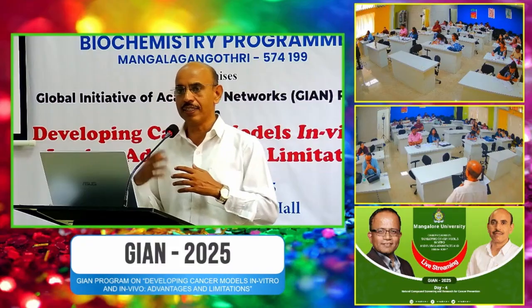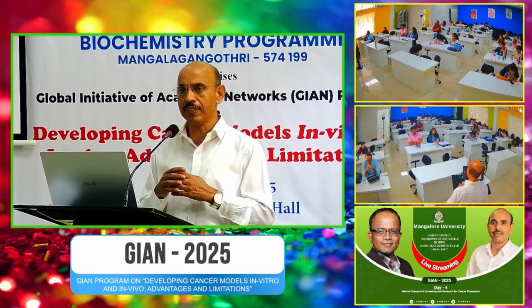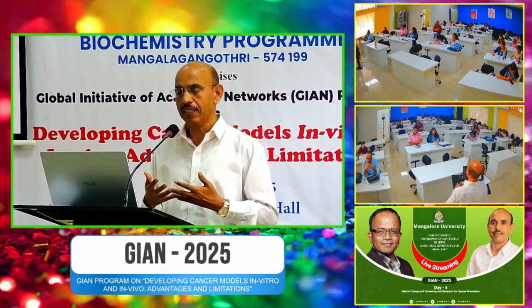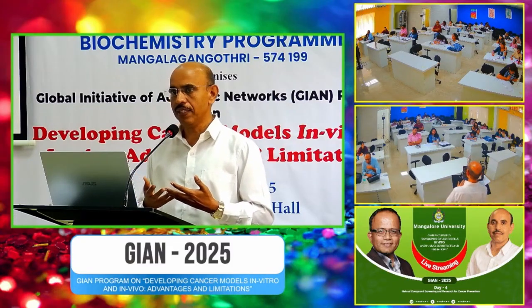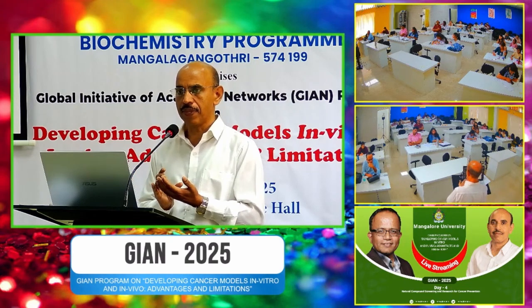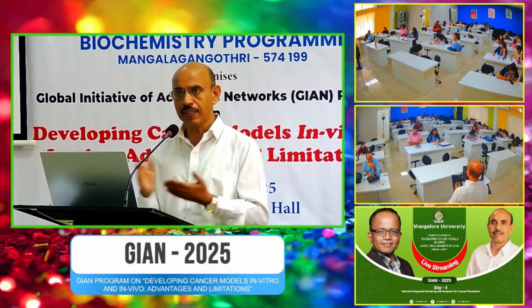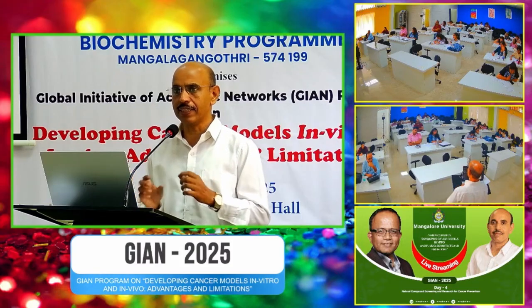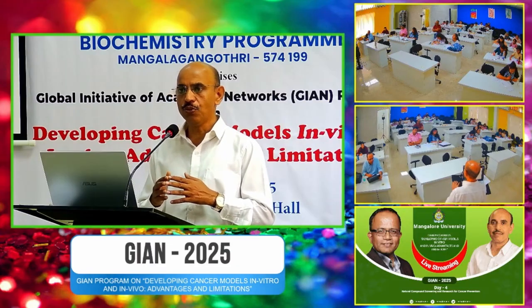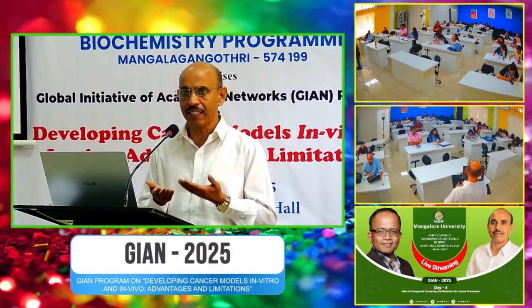passaging. So the best way is that you take the culture with the cells, observe under an inverted microscope, and make sure that it reaches only around 70 to 80%. Once it reaches that stage, then immediately you go for passaging, that is subculturing of the cells. And that way you are avoiding the losing of the cells. Cells will start getting detached if the number of the cells increases.